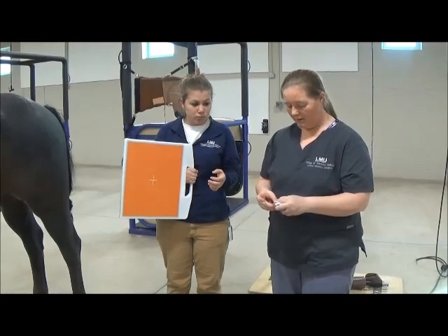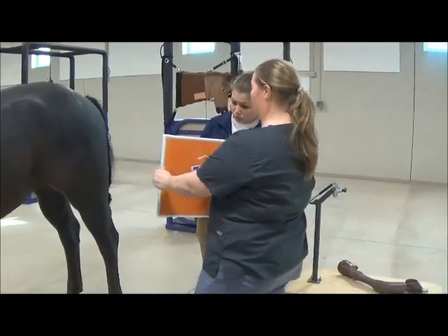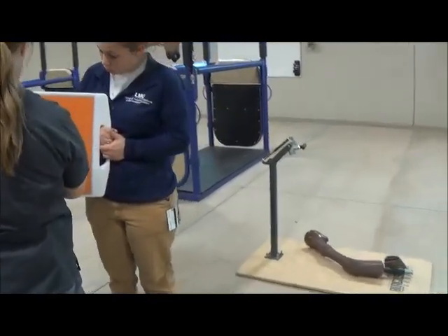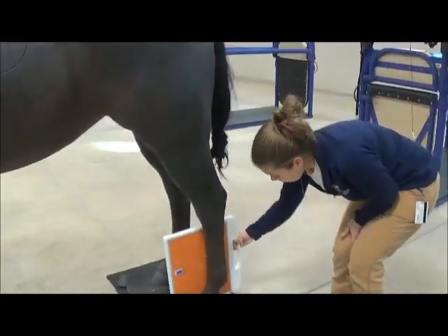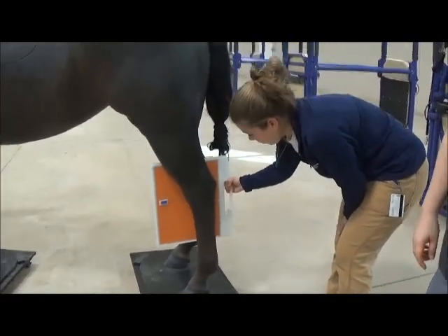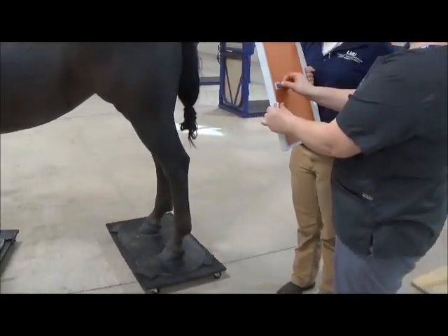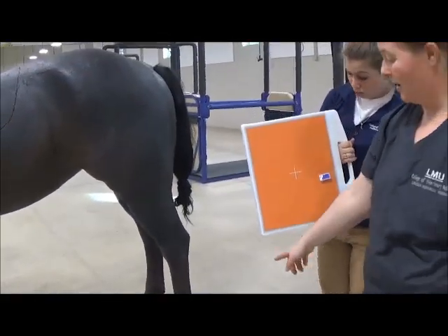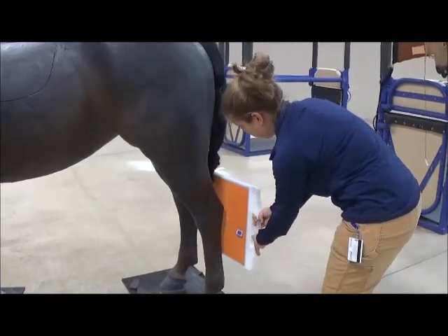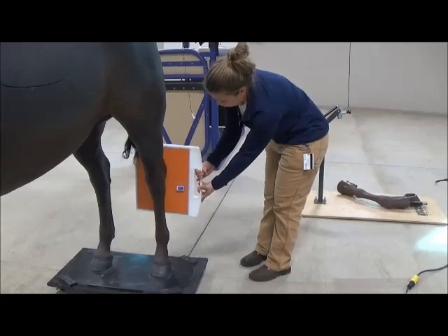Okay, so we're going to start with our lateral view like we did before. So the marker is just going to be the left, and it's going to be on the front of the plate. Okay, so then Randy would place the plate lateral on the hock like that, and then we would take the radiograph from there. Then the next view would be the DP, and unfortunately we have to change the marker position so that it's now on the lateral aspect. So then she's going to set up for a DP position, and you can see that the marker is now in the lateral aspect.